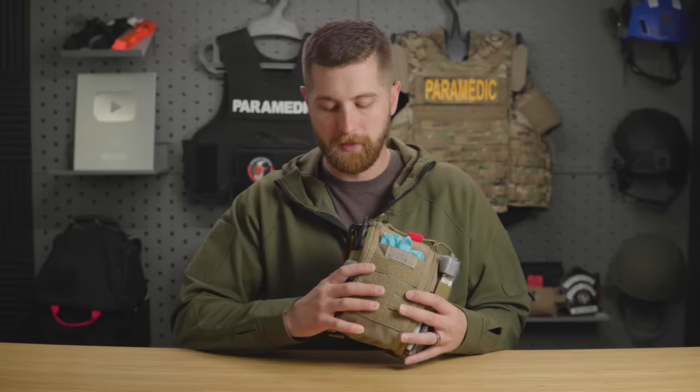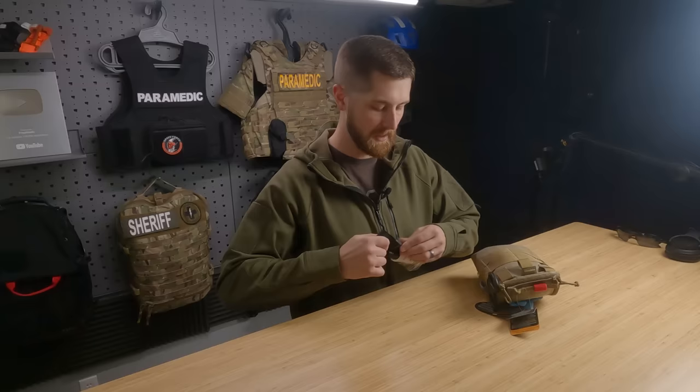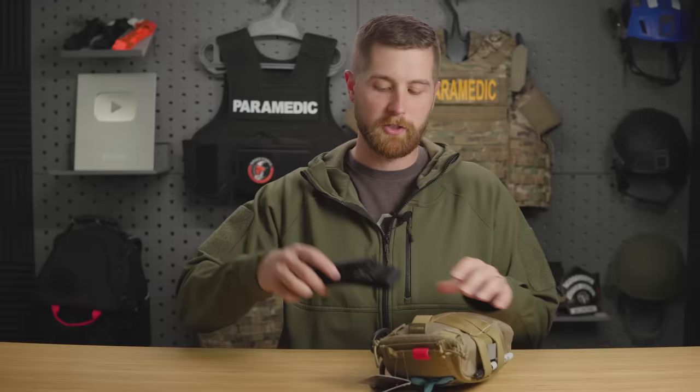Now, these all come in the wrapper, and this comes stocked and loaded like you see here. But once you get a tourniquet, I would advise that you take it out of the wrapping first thing. This is going to take valuable seconds to undo it, and I'm trying to do it without making too much noise for the mic, which is why it's taking me even longer. But get this out of the wrapper. You can throw away the instructions because if you're carrying this, you should know how to work it.